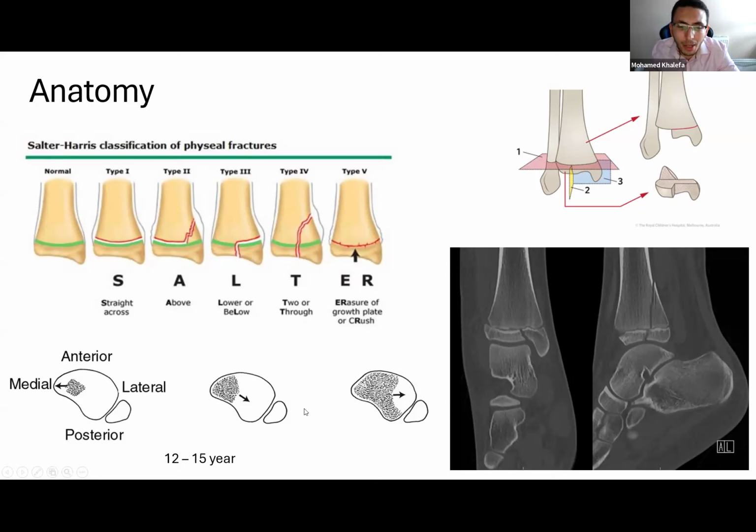A special subtype, this might be FRCS level: when you come to the ankle around adolescence, between 12 and 15, the physis starts to close from the medial side, then goes anterior and posterior, then to the central part, and closes laterally last. So when they fracture, they get this weird pattern. You can say it's a Salter-Harris 3 on the AP, and maybe a Salter-Harris 2 or 4 on the lateral. It's quite confusing. That's called a triplane fracture. This is how the fracture goes: it goes into 3 different planes, as evident by this diagram here. Just to be aware of; I don't think at ST3 level they ask you that deep.